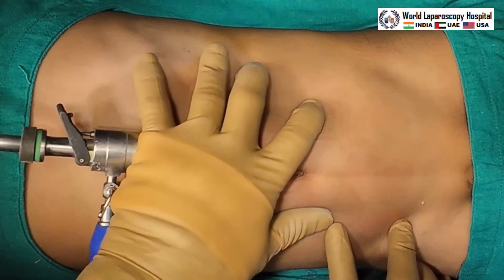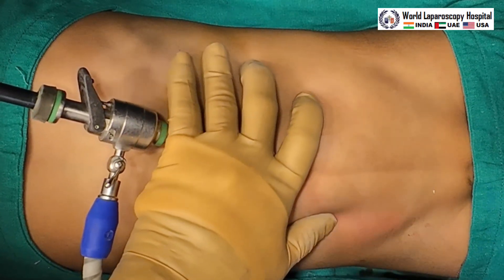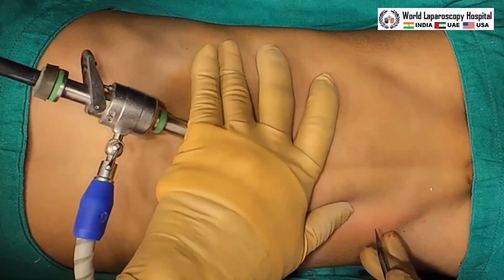Now the telescope is introduced. For the two ipsilateral ports, we have to be careful by putting the finger and indentation so that we should not injure the inferior epigastric vessel of the opposite side.